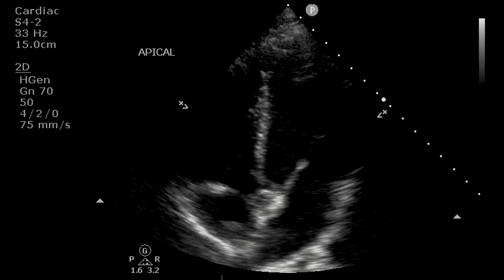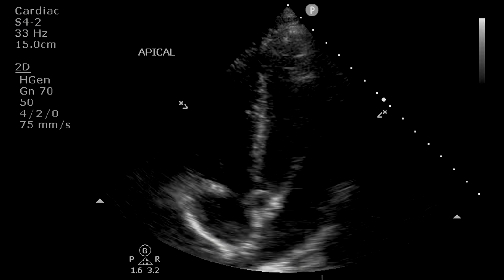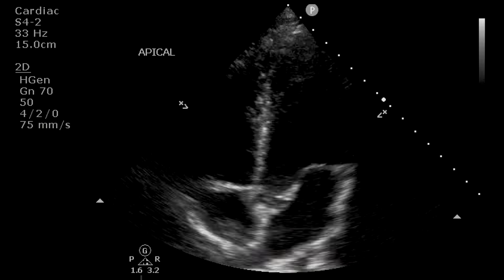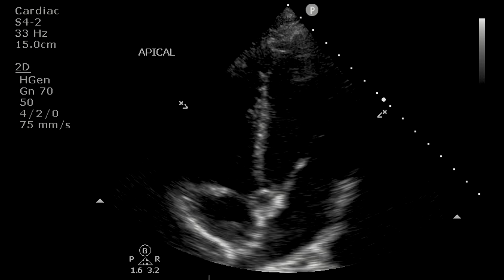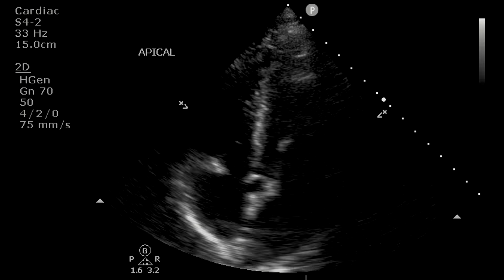Number two is if you have incomplete windows, right? This one is similar, but from a different perspective. Let's say you have an imaged left ventricle. Here we go. There's the apical window. There's no foreshortening here, but I have some lung shadowing on the right-hand side of the screen that is overlapping that left ventricle. Now, we could probably extrapolate in our mind's eye where that border may be. And if we scoot our probe around, we can see through it. So one image doesn't tell the whole story, right? You can probably work through this.